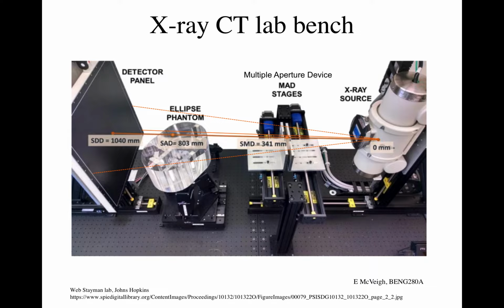For example, if you're imaging multiple frames of the same thing, right? When you're doing a contrast injection, or it's a patient who has been imaged before and is coming back for a follow-up image 2 weeks later, you should be able to actually image them with about 1/3 of the irradiation that you got the first time. Because there's a lot of stuff, you know what it is and you don't care what it is. So why even illuminate it?